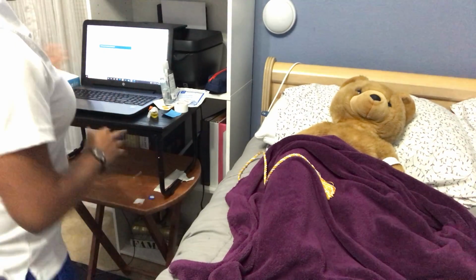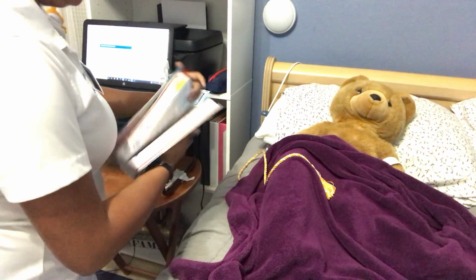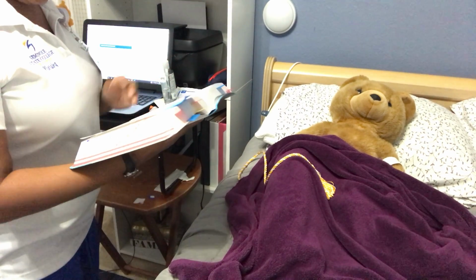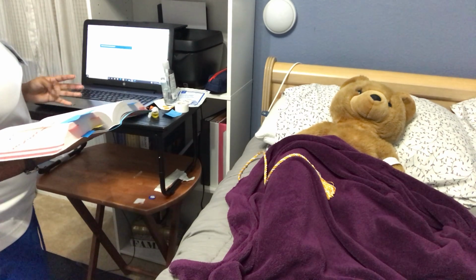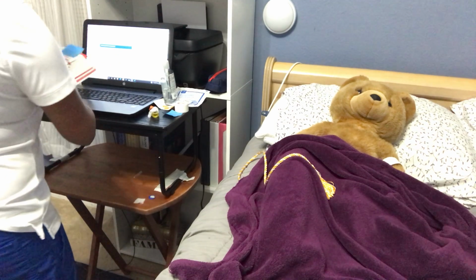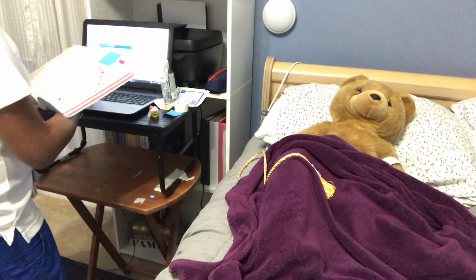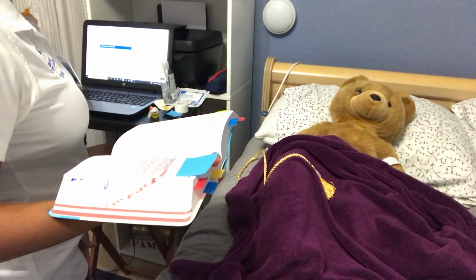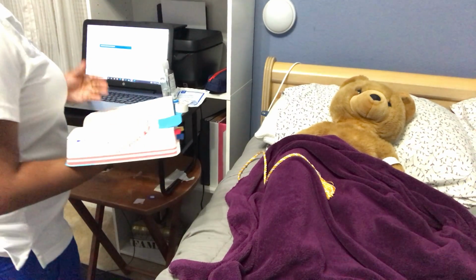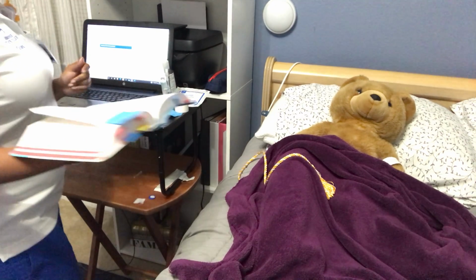Okay. Alright, like I said before, Mr. Simpson, the healthcare provider put an order for medium dose insulin lispro, because your blood glucose level is at 200, and I'm going to give you 4 units of the medication at the anterior aspect of your thigh. It is a quick procedure, and it's going to be done before meals and at bedtime too. Okay? Okay. Alright.